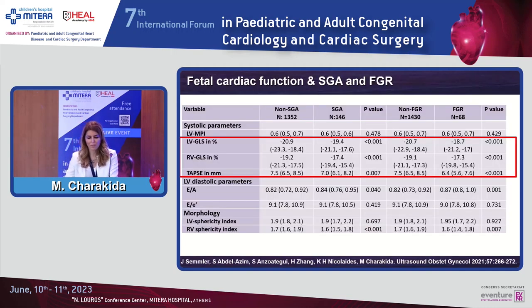Our group, and myself, have done extensive phenotyping at different stages in pregnancy, 20 weeks and 36 weeks, at King's, and we have demonstrated that of the variety of cardiac measurements that we can perform, strain is more sensitive to pick up early myocardial changes, not only in the severely growth-restricted ones, but also in the small for gestational age ones.